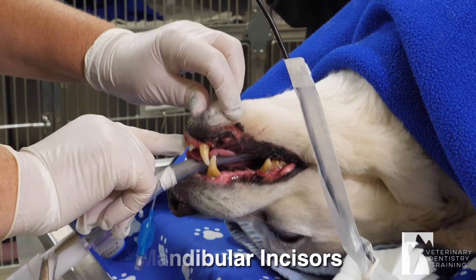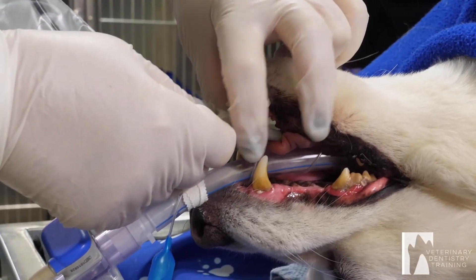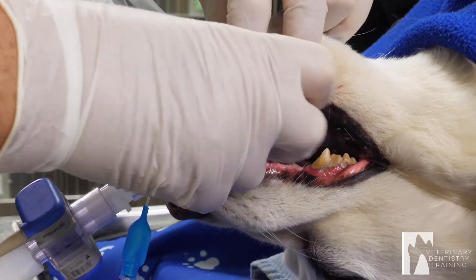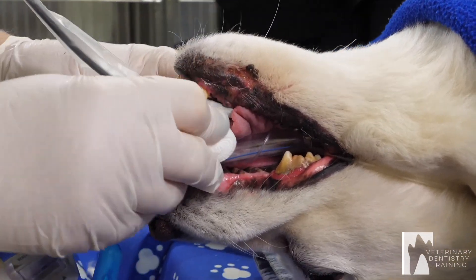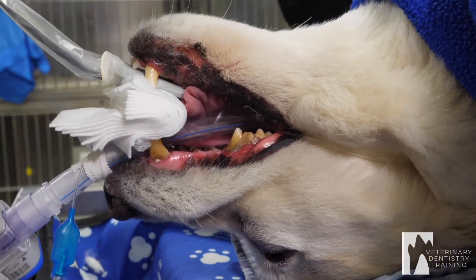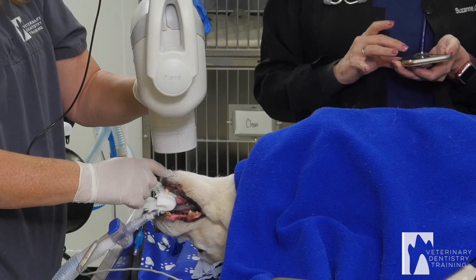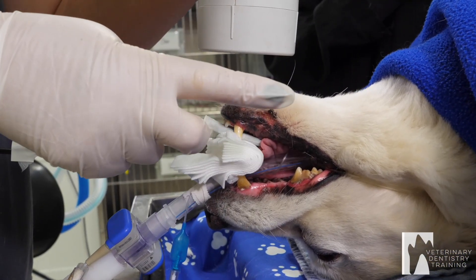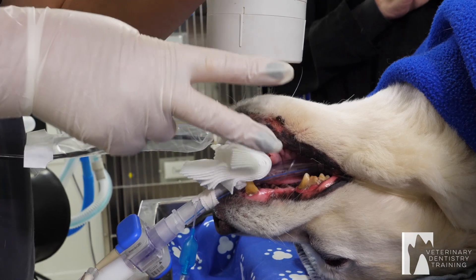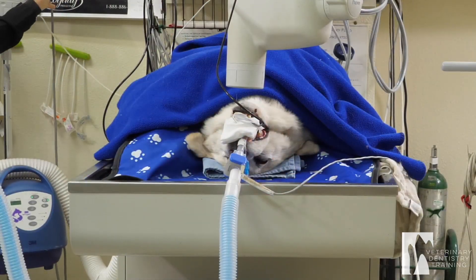I'm going to do incisors first. I'm going to put the sensor just in front of the teeth that I'm shooting. Put gauze to stabilize it. I'm going to come down centering on the roots — it's a peace sign looking at it from this direction. The bottom finger is the sensor, the top is the angle of the x-ray head. I'm going to x-ray.